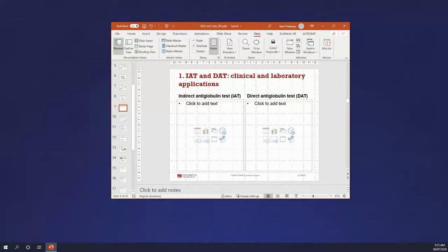Anytime we see spherocytes in a blood film, the first thing that you could do is to ask for a direct antiglobulin test, because it takes about 2 minutes. So when we see spherocytes, what information does the direct antiglobulin test give us about our extravascular hemolysis?